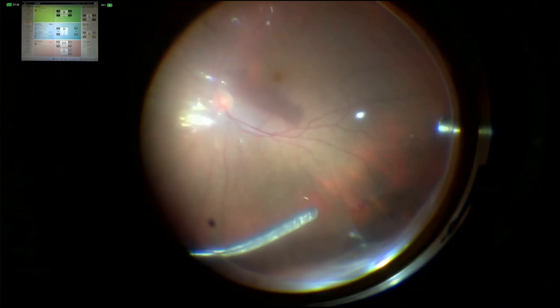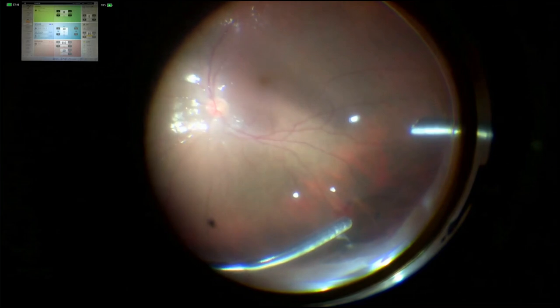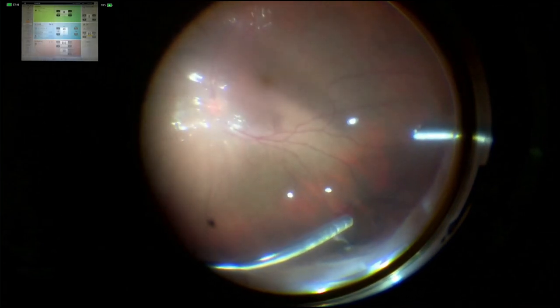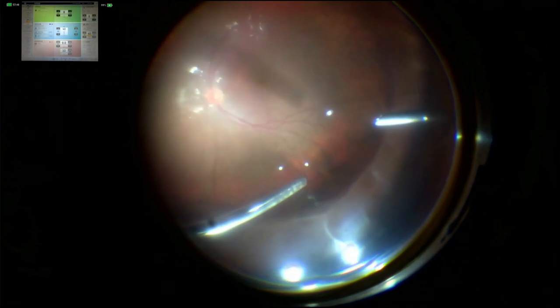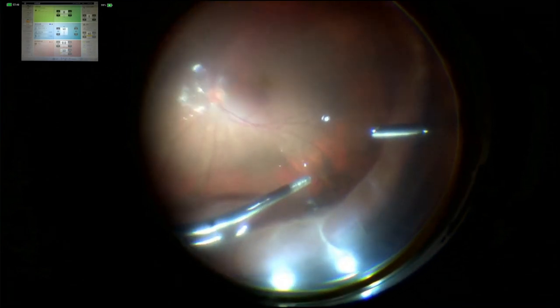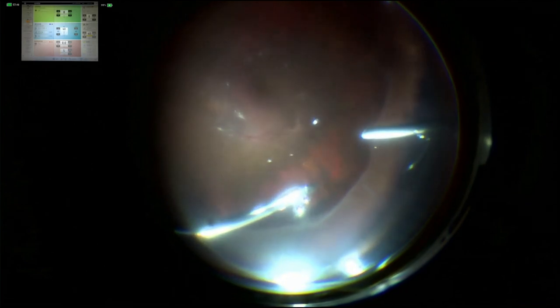Now, I will do fluid air exchange. And to attach the periphery of the retina, I will show you now. Now, air is coming. And you can see the view under air. And here is the retinal tear. So we will remove all the subretinal fluid with this technique.